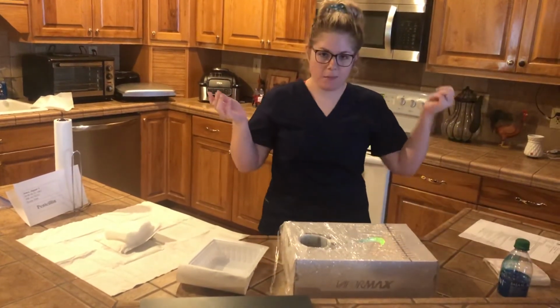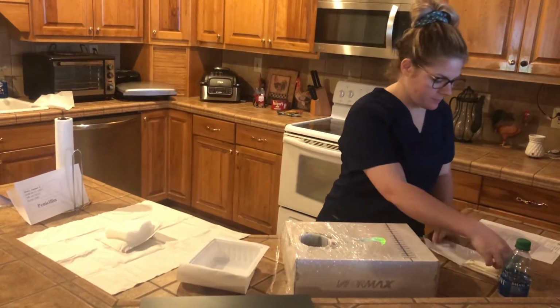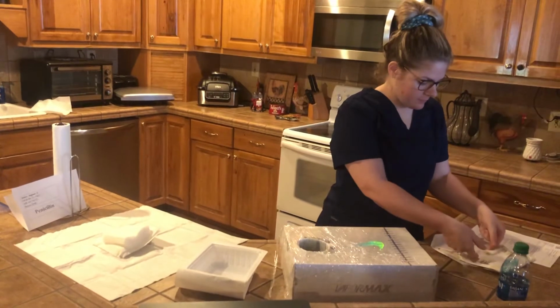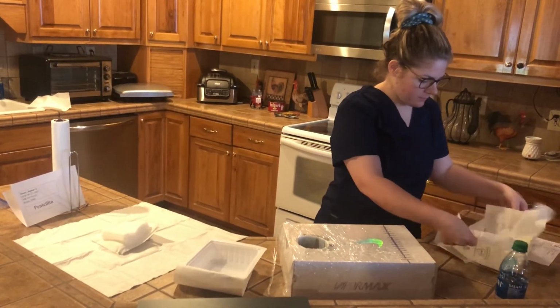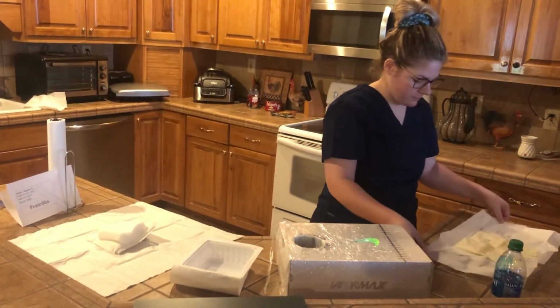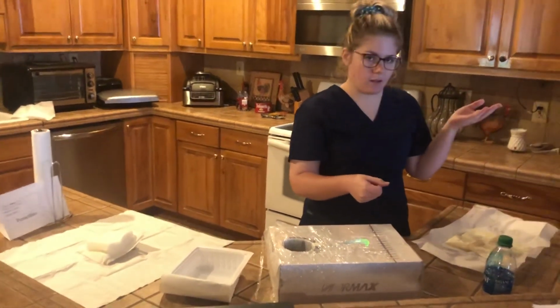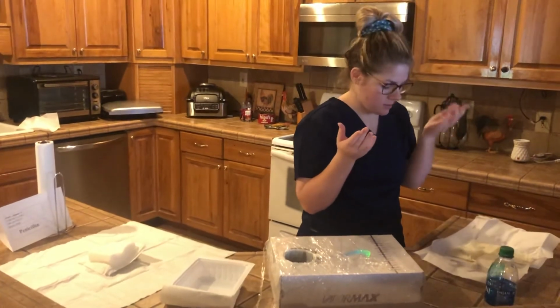I will now put on my sterile gloves. I will use my non-dominant hand to put my dominant glove on first.